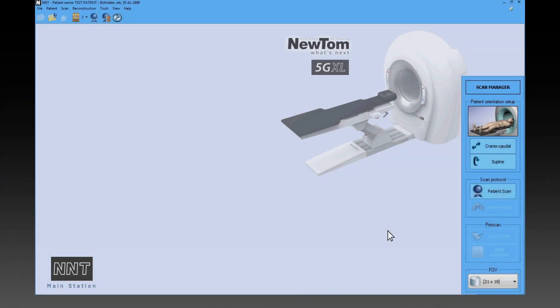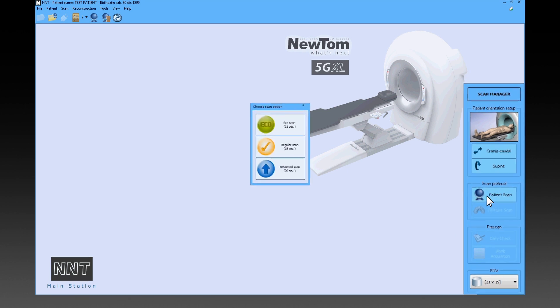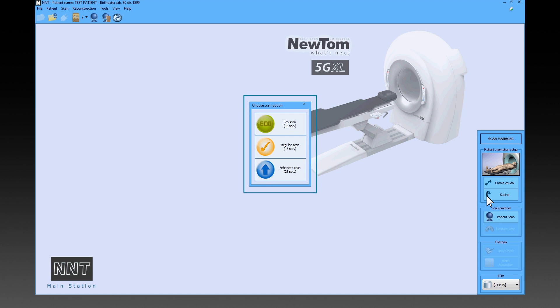To start the scanning procedure, select the Patient Scan button and choose from EcoScan, Regular Scan, and Enhanced Scan.